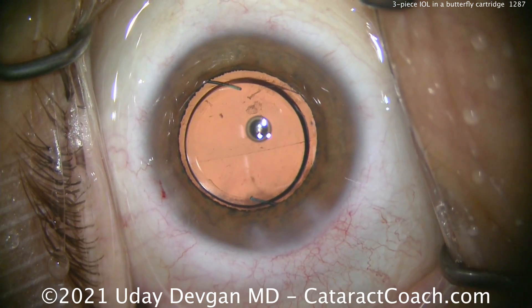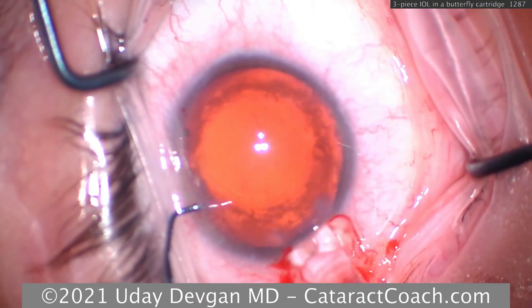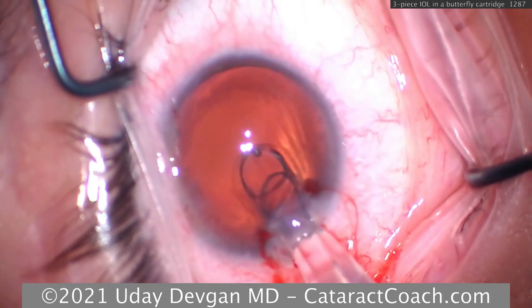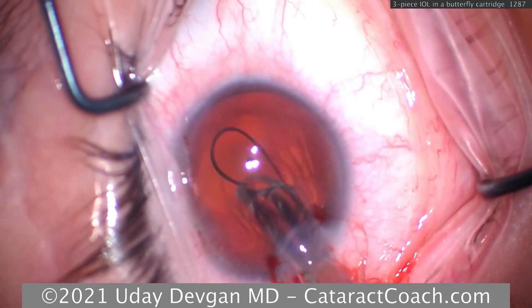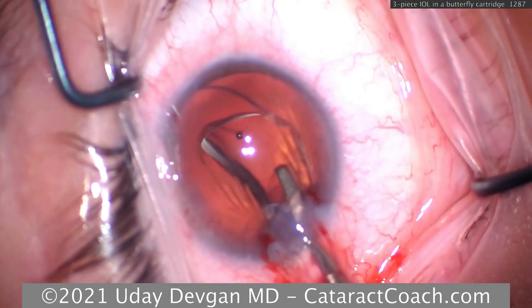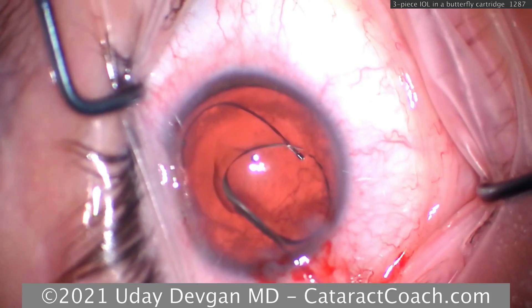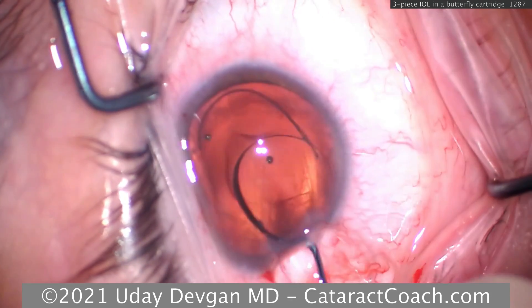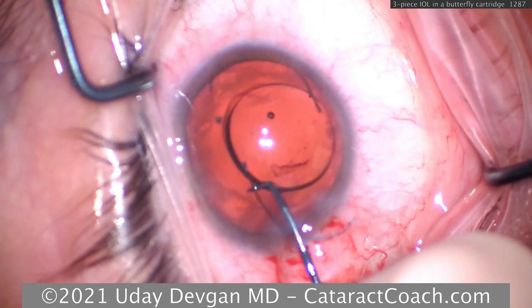For high myopes, never aim for plano — never, never, never. Here comes another lens delivered the same way: leading haptic going into the capsule bag using the same injector delivery system. Opening it up and making sure it's in the correct orientation — there's the 7L. The lens doesn't always come out exactly as you expect, and that's okay; just take your time and make sure it's the correct overall orientation.